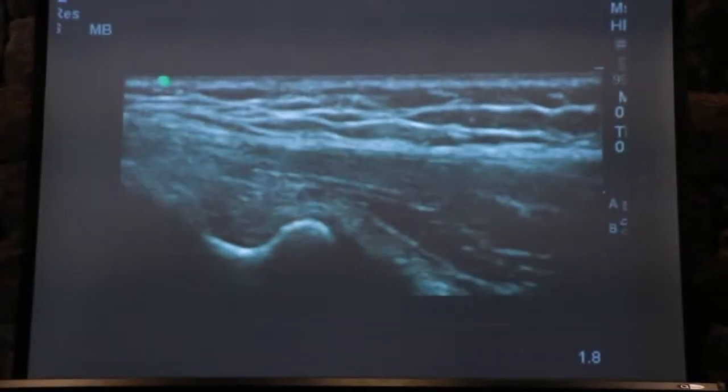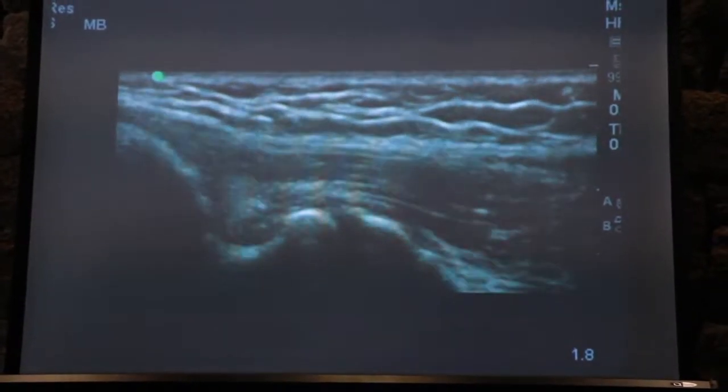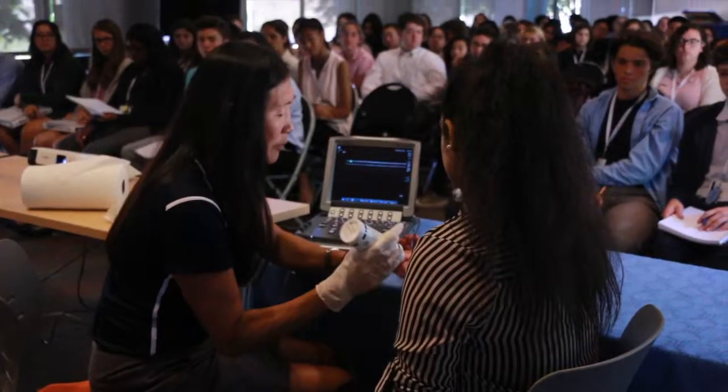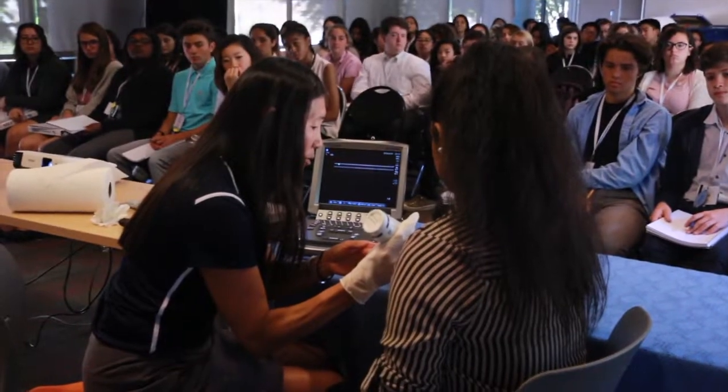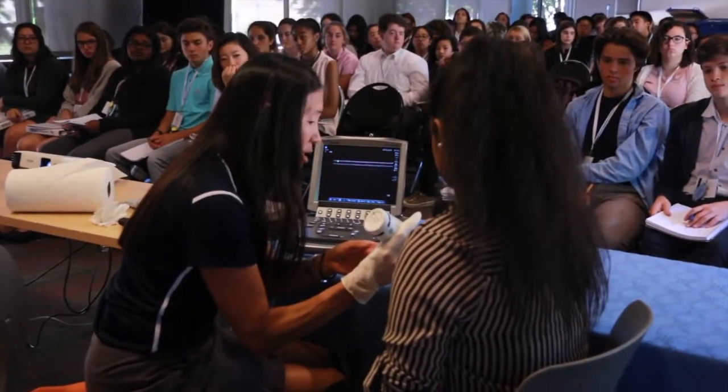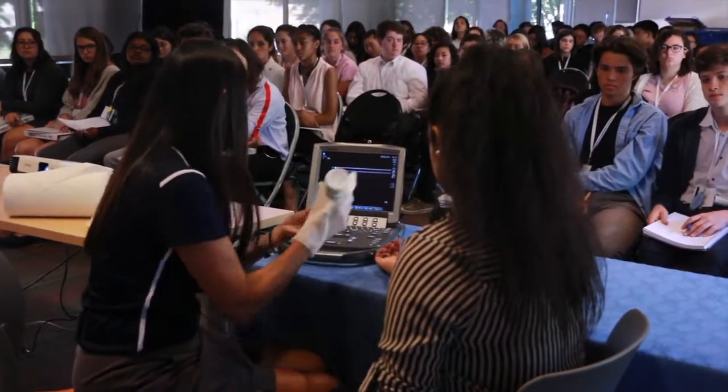It's just a really exciting tool. For the students to be able to see the ultrasound performed on one of their classmates — they can see what the inside of the joint looks like, what the tendon looks like, what the nerve looks like. It really brings it to light.